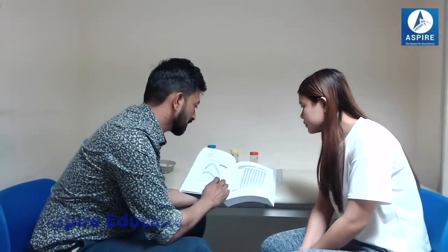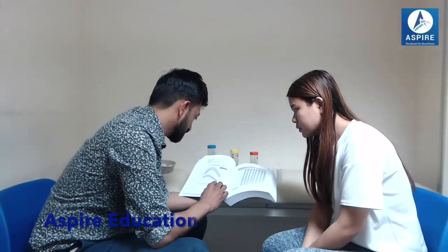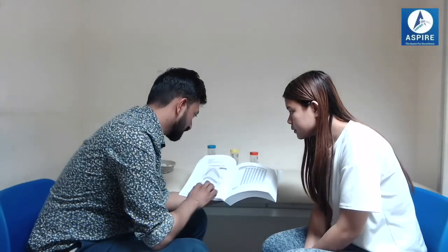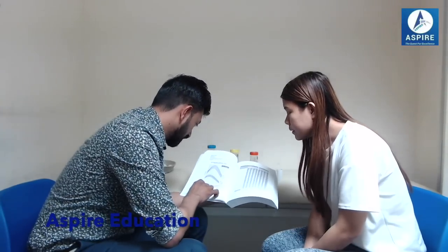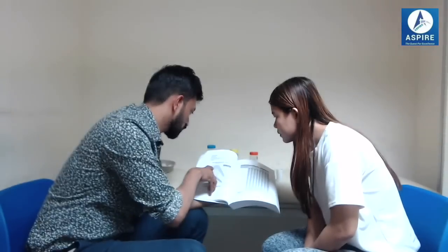Let me show you what exactly we need here. This is a graph for the peak flow meter. This graph will tell us what our normal value is. For this we need three things: the age of the patient, the height of the patient, and whether the patient is male or female. For you, your height is 190 cm and age is 22. If you plot the graph here for a male patient, it comes out at around 610 to 620.